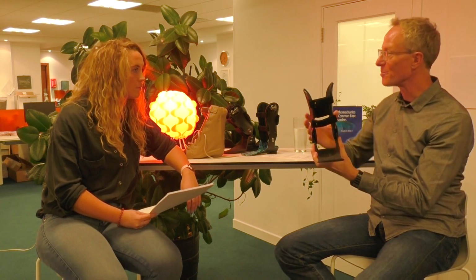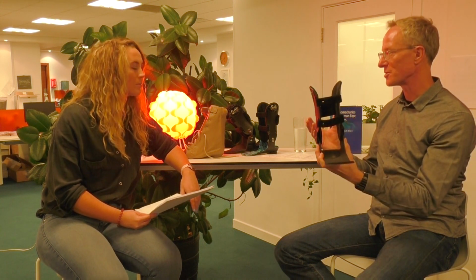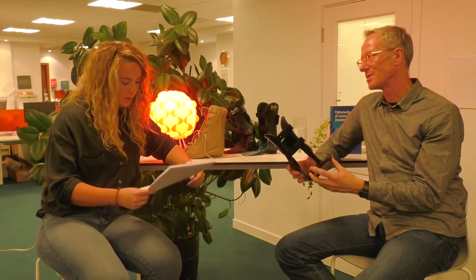So joint coupling is about getting all these joints to function, you know, as nature intended. So that's really the concept.